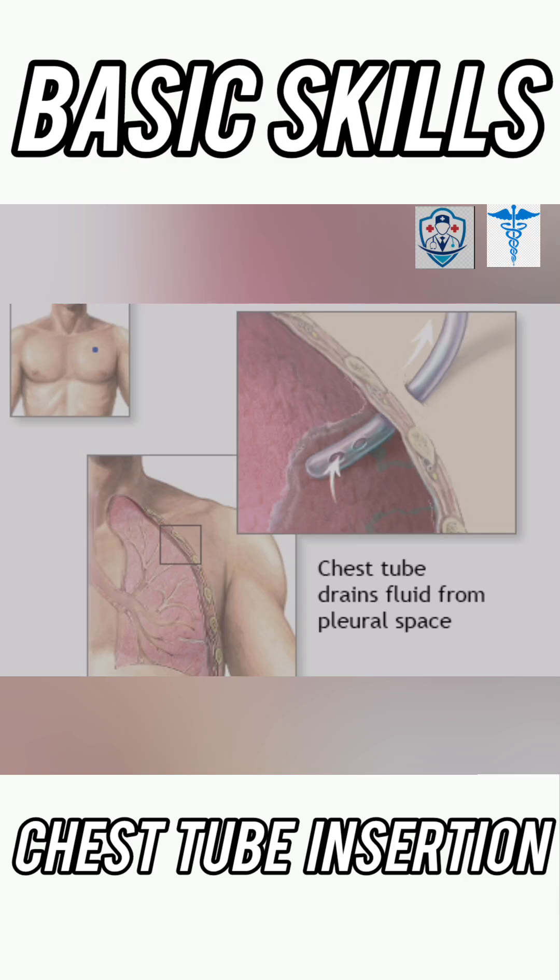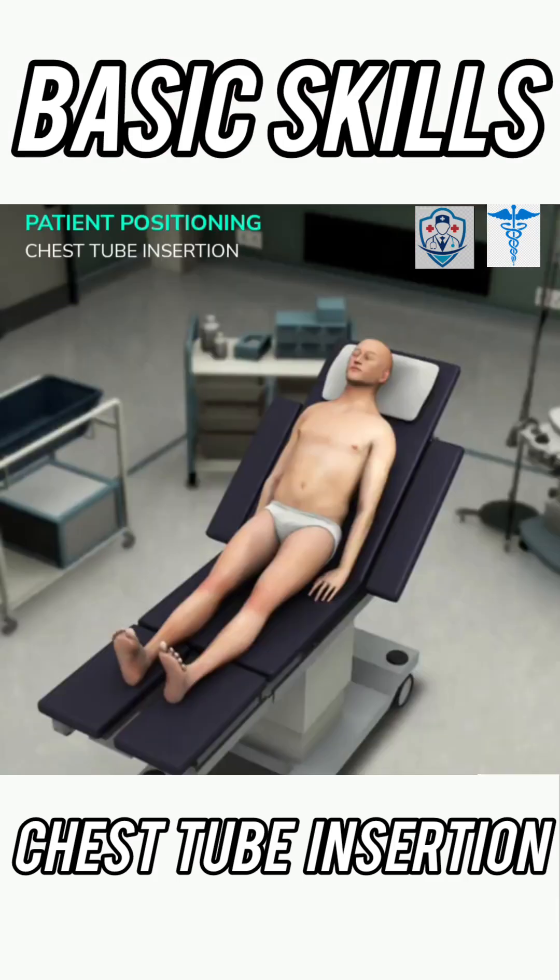Ever wonder how a doctor performs chest tube insertion? Let's break it down. First, position the patient in a semi-recumbent position.